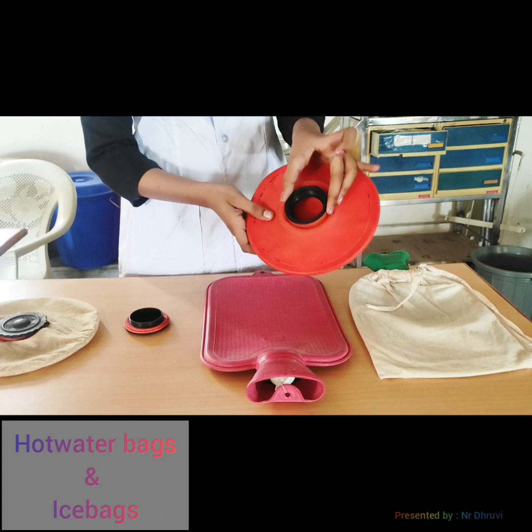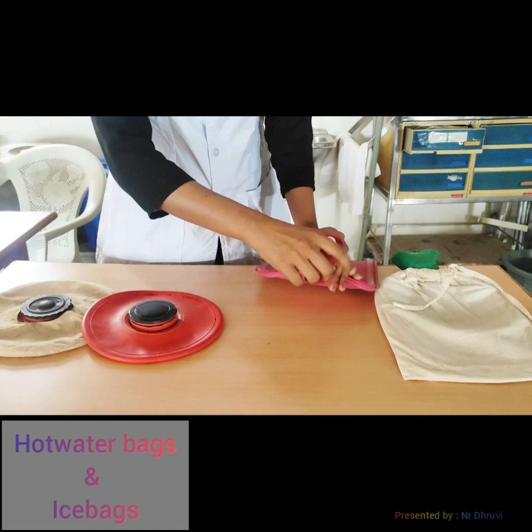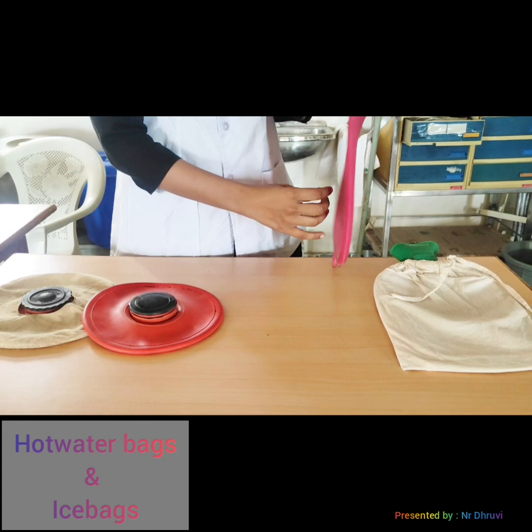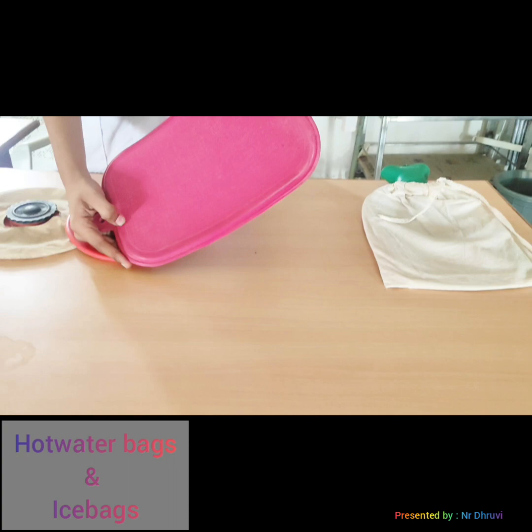For the hot water bag, you pour hot water into it until it is filled up about three-quarters. The hot water bag is made of rubber material and is used to provide warmth to the patient, make the patient comfortable, and reduce pain.